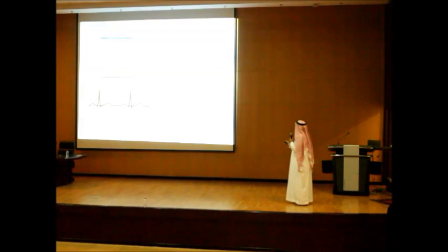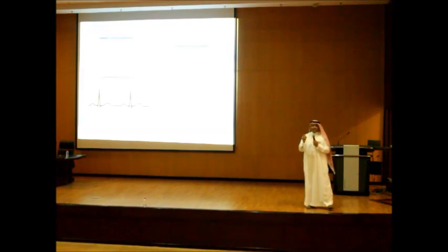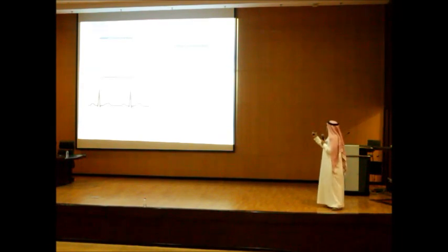So this is the easiest and most straightforward. Everyone does this. The other thing is, if you are so crazy, you can measure the small squares, right? Each one of these large squares is made up of 5 small squares.